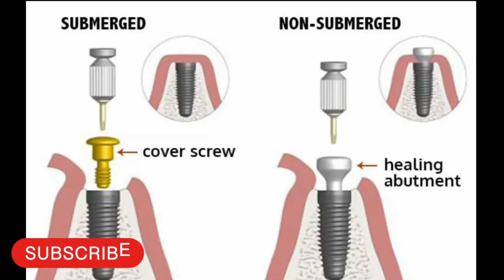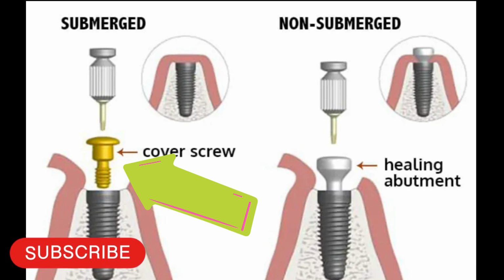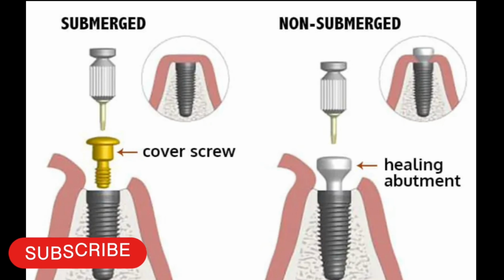Guys, on the left side you are able to see the cover screw. Cover screw is a cover which is placed on the top of the implant. It helps to prevent bone, soft tissue or debris from invading the abutment and connection area during the healing phase.